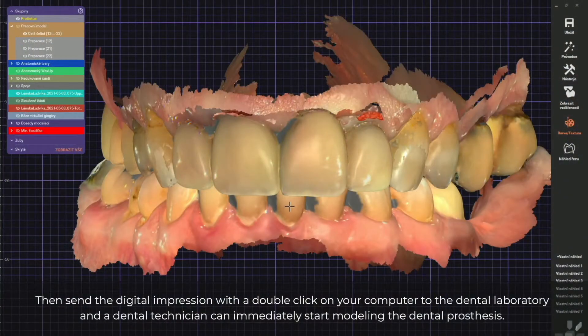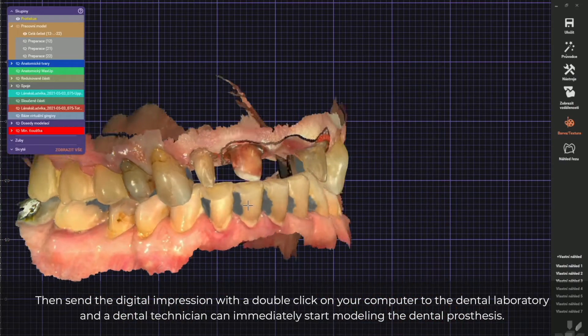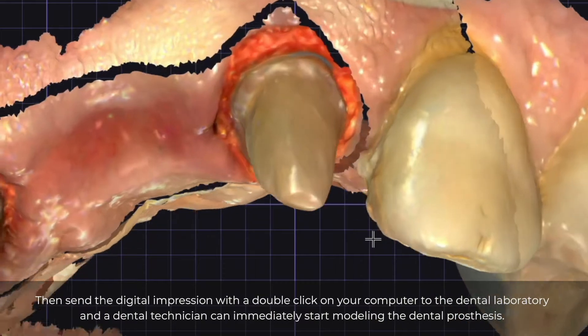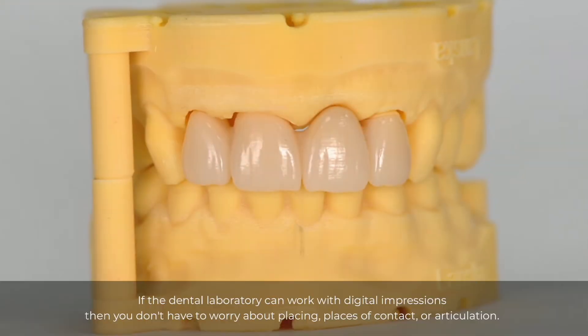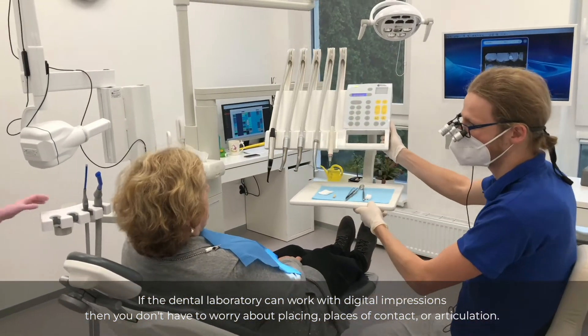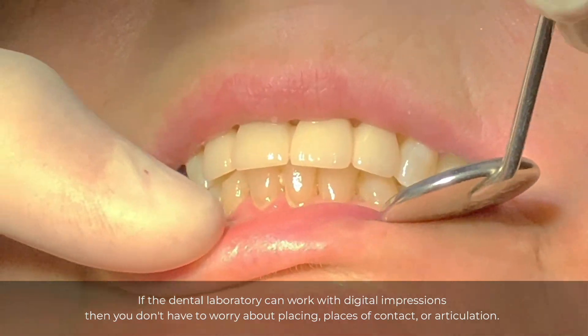Then send the digital impression with a double click on your computer to the dental laboratory, and a dental technician can immediately start modeling the dental prosthesis. If the dental laboratory can work with digital impressions, then you don't have to worry about placing contacts or articulation.